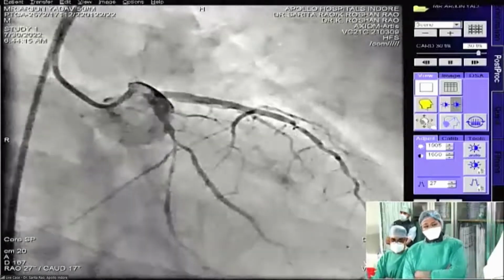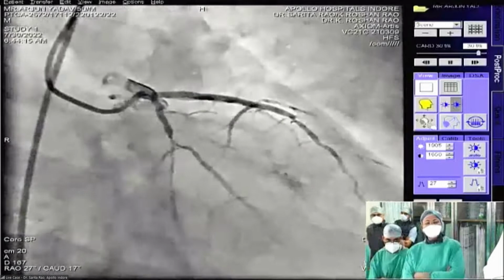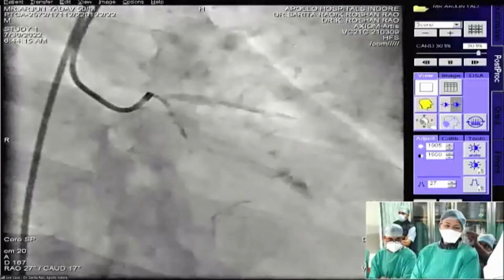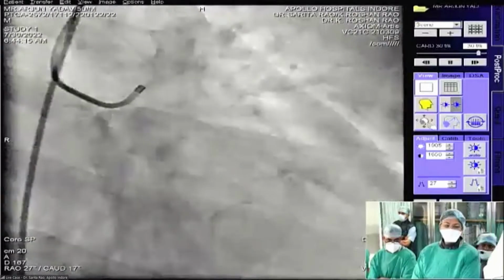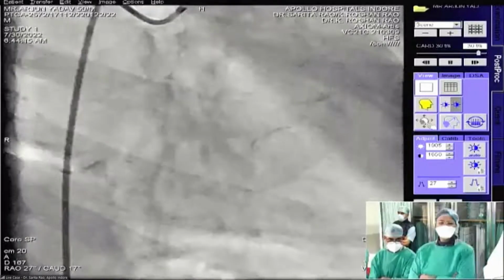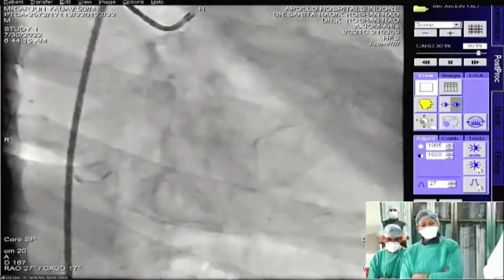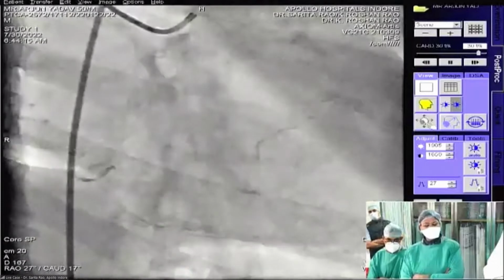Yeah, so Dr. Sandeep Bansal and I were just chatting while you were presenting. With an ejection fraction of 5 to 10% and having thick muscle, those two are not going hand in hand. Angiographically, LVEF looks reasonably better rather than 5 to 10%. The motion on the X-ray machine that you see, obviously, yes, that's true. So probably it is a bit better.